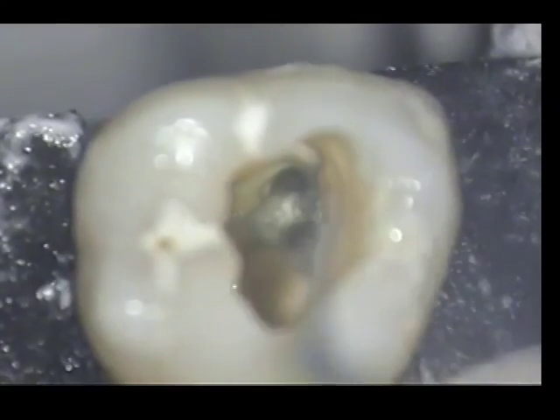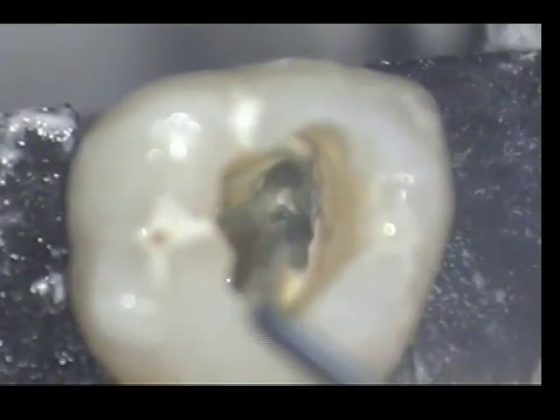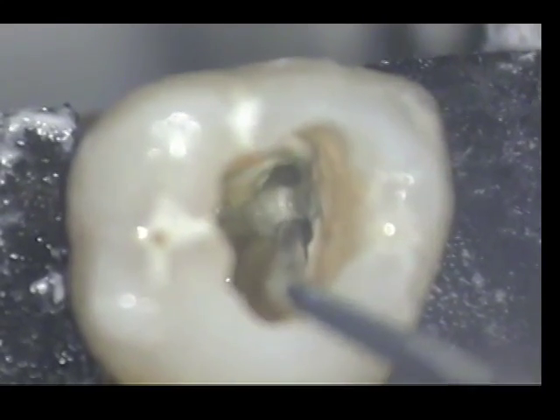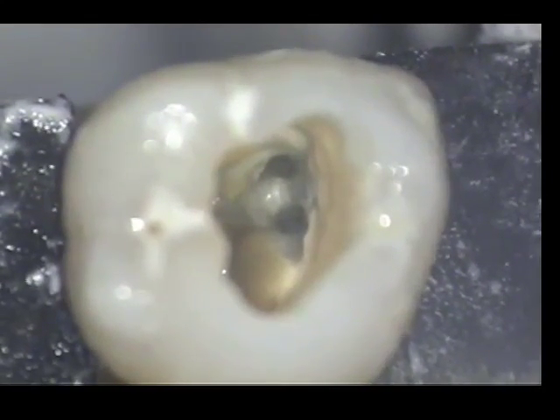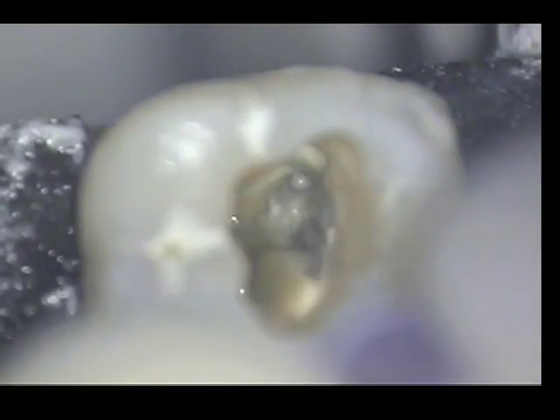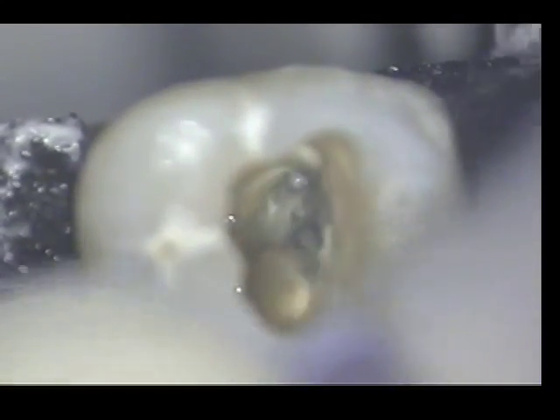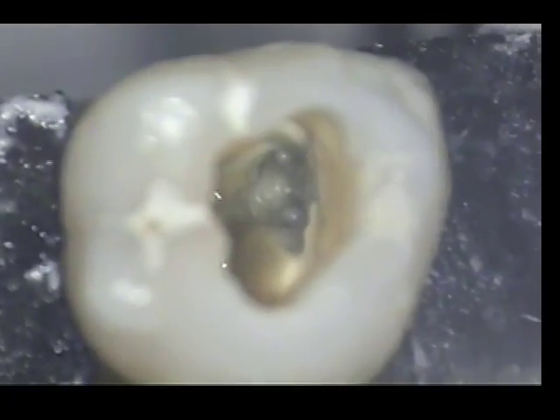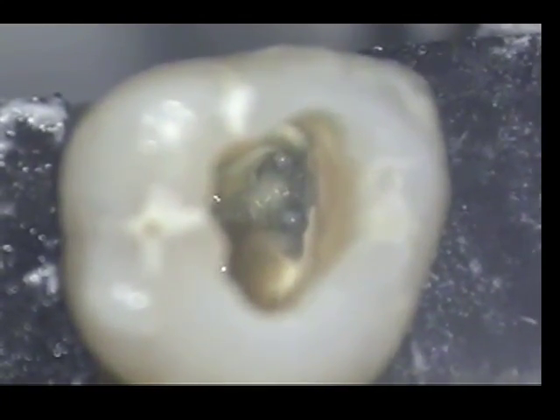There is an isthmus between MB1 and MB2 that I check with an explorer to make sure it is hard tissue, not harboring an additional canal, that it is not an additional space where a sheath of tissue exists. Probing with a reamer only allows me to remove a small amount of extra tissue on one of the walls. I do not find a probable space.